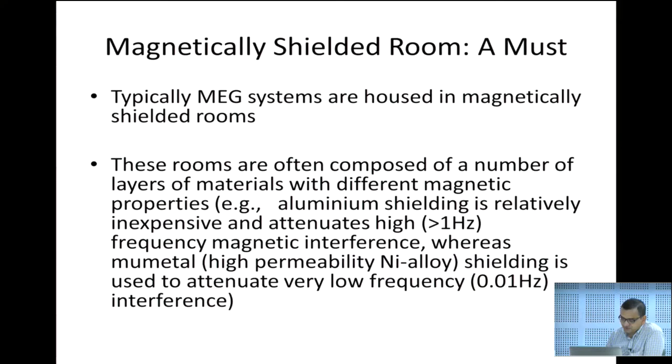And it depends on how you want to shield. MSRs have different sensitivity characteristics, because of what kind of material you're going to use for creating this magnetic shielding room.